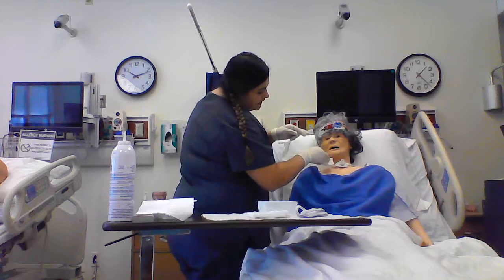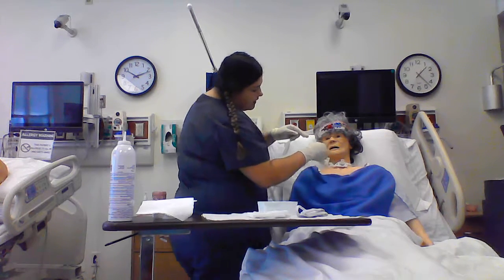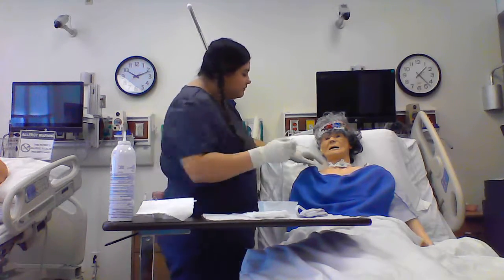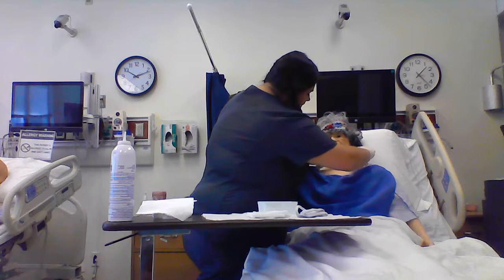And you want to make sure, like I said, that you stay as sterile as possible doing this. You can do this with these 4x4s. You can do them with Q-tips, which I'm going to grab as well. And I'm just making sure that we get this nice and clean for my patient here.